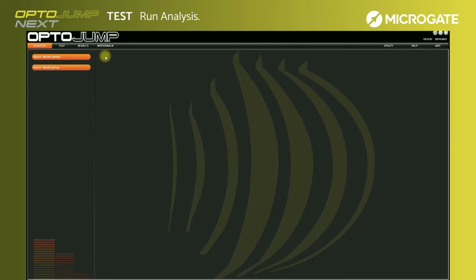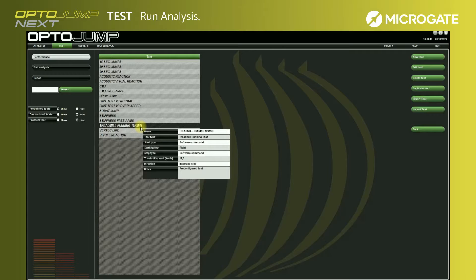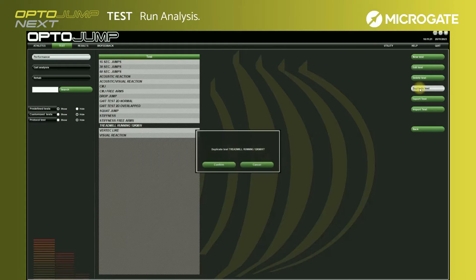Once the bars have been connected, go to the Define/Modify Tests section. In the Filter section, only show the predefined tests. Here, the treadmill running test is already entered with a speed of 12 kilometers per hour. Clicking on the test will show all the parameters.